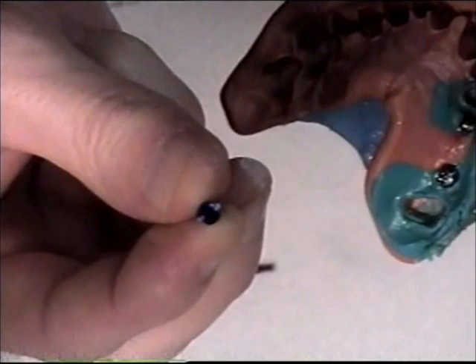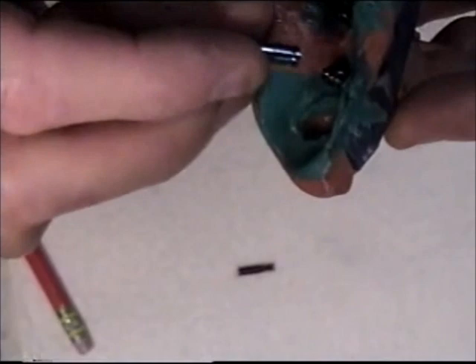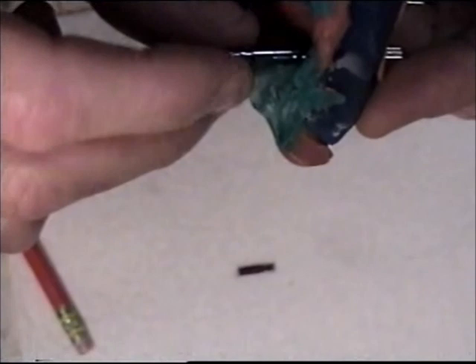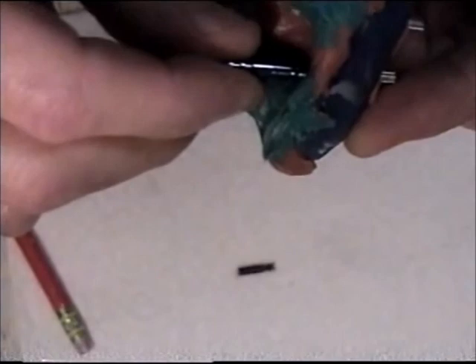This would be the base of the implant in the mouth, and that's what we're going to duplicate with our model here. So I'll take the analog, and it has a female part. Pickup is a male, and there is a hex part on the pickup. Push it together, the analog, snap it into place. Now it's secure. I'll do the same with 3.4.